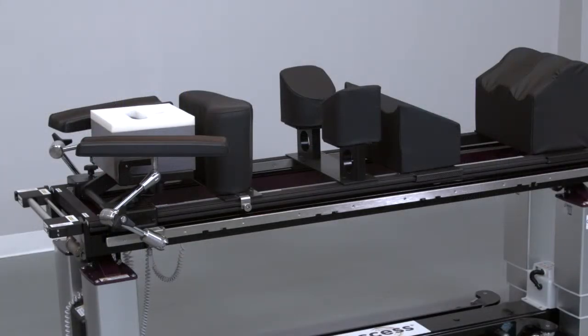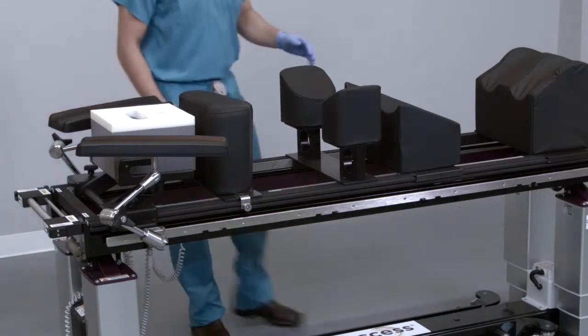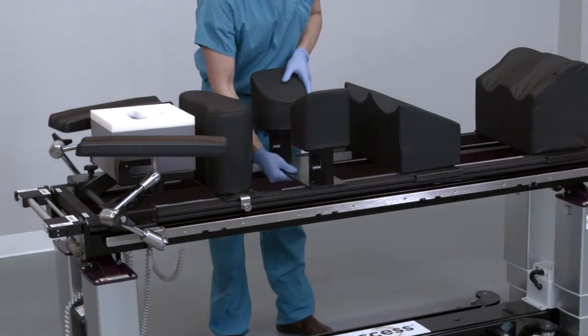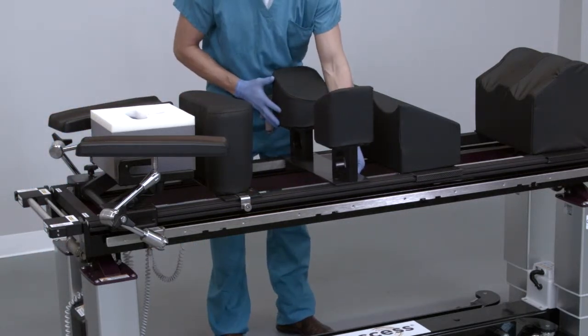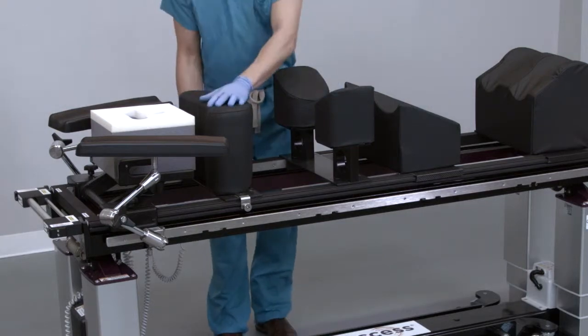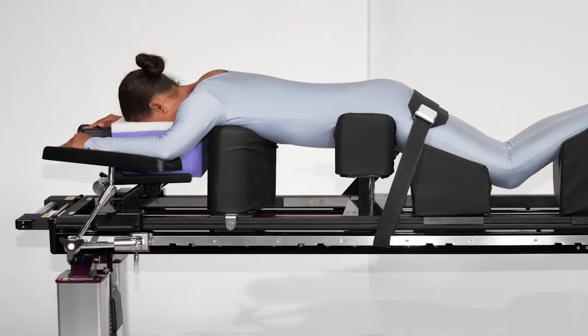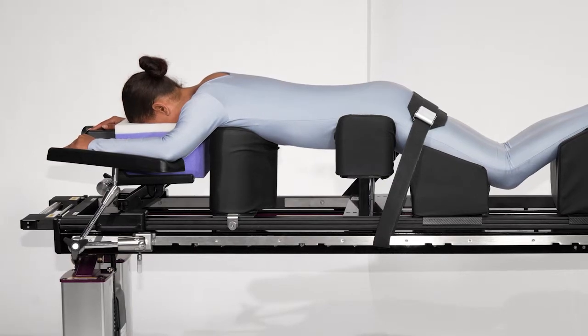While the patient is on the gurney, orient the gurney so the patient's sternum is aligned with the chest piece and then slide the pelvic system left or right to align it with the iliac crest of the patient. This will minimize pad and patient adjustments after patient transfer.